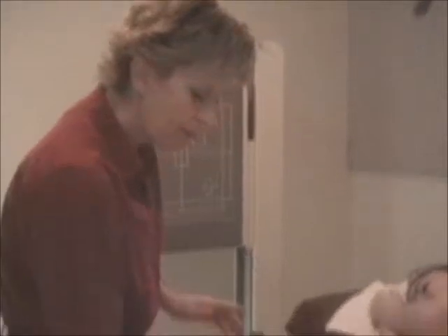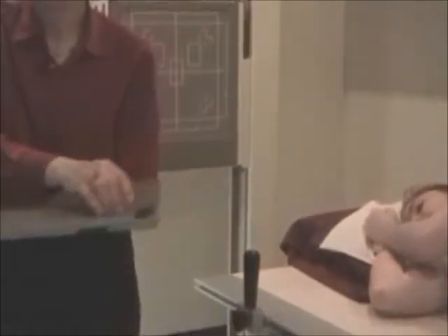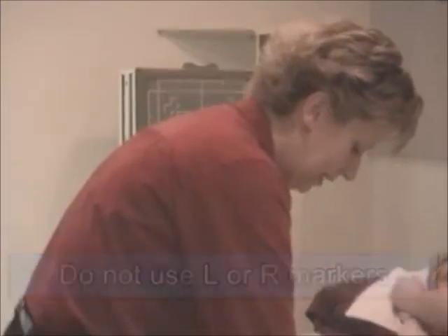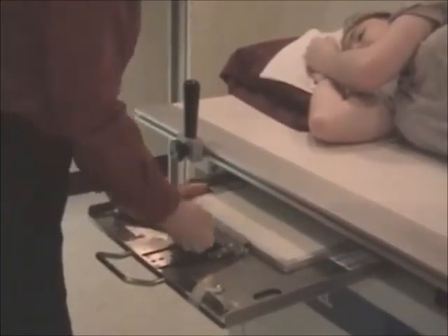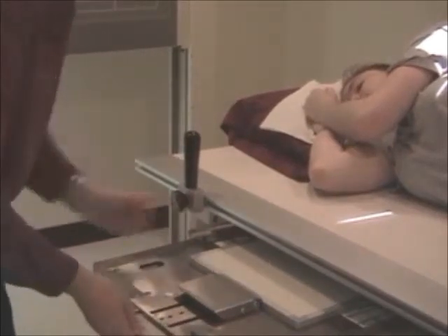Now, the big films are for the esophagus. We'll move to 10x12s for most of the stomach or the upper GI films. And we will not use an L or an R marker. We will just use tech initials. I'm placing the cassette lengthwise in the Bucky tray for a right lateral, and the ID is to the top. Collimate to your 10x12 lengthwise.